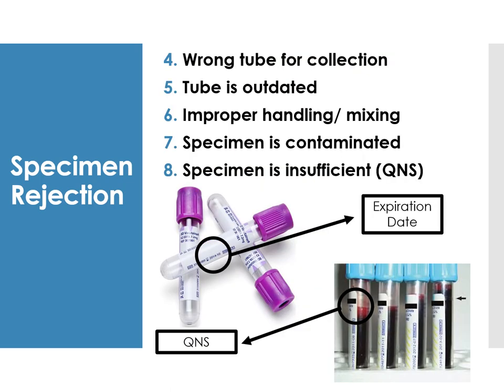Other reasons for specimen rejection include: wrong tube used for collection, outdated tube, improper handling or mixing, contaminated specimen, and QNS — quantity not sufficient. Always check the expiration date of the tube. Both underfilled and overfilled tubes are grounds for rejection.